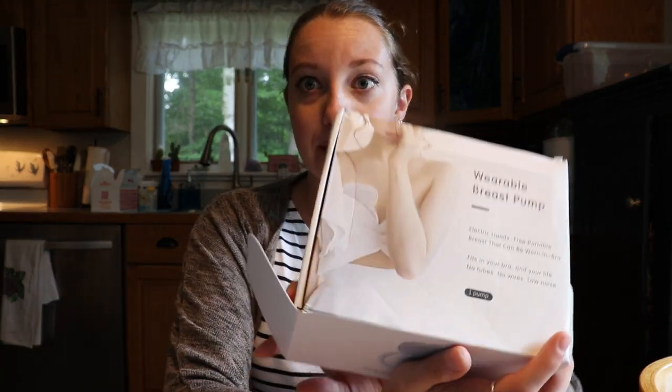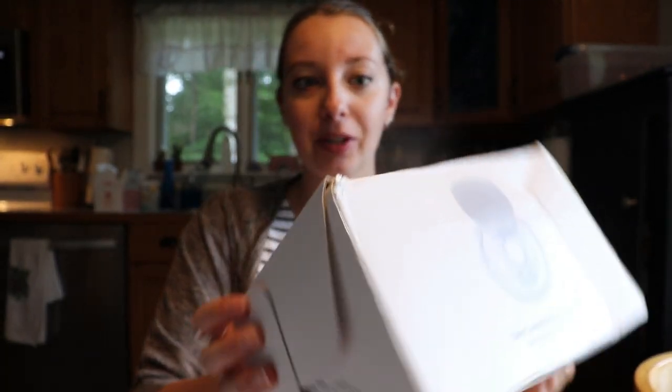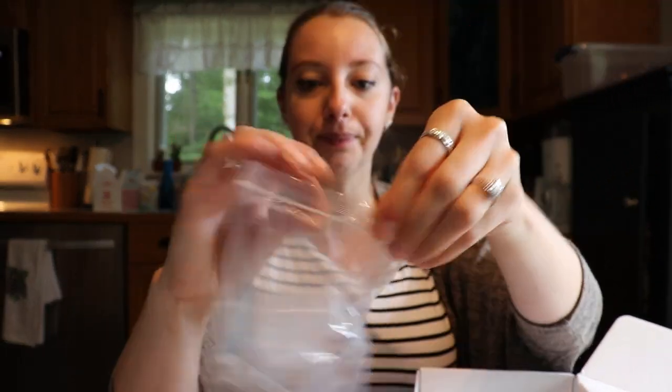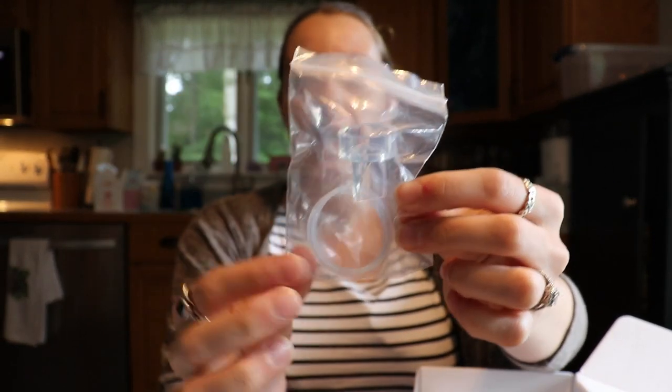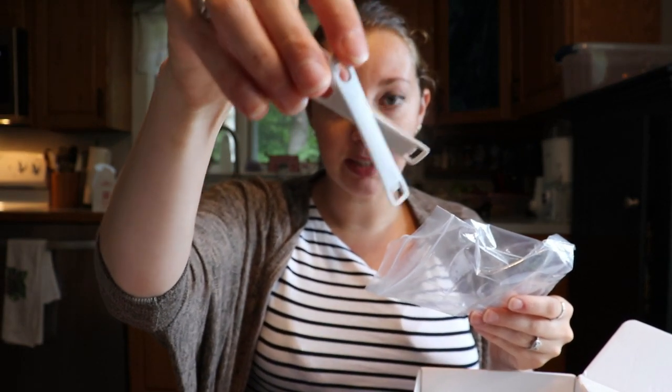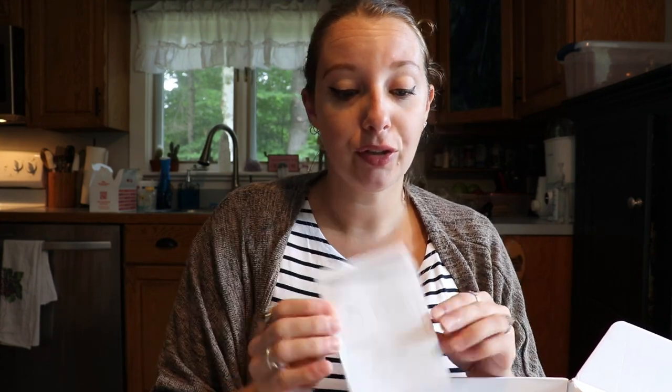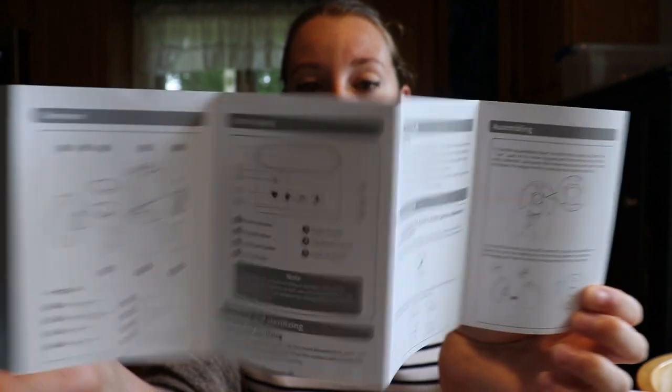Before I get into my stuff, this is the box that it comes in. Mine's a little bit destroyed because it got destroyed in the mail. But it does come with some extra accessories. You do get a duck bill flange and you do get the bra extenders, which is really nice that they give you that. I'll have everything linked down below for you guys. And if you stay to the end of this video, I do have a coupon code that you guys can use to get your own Mom Cozy pump. It also comes with the manual, which is really well put together — pretty straightforward. It shows you how to put stuff together and how to clean everything.